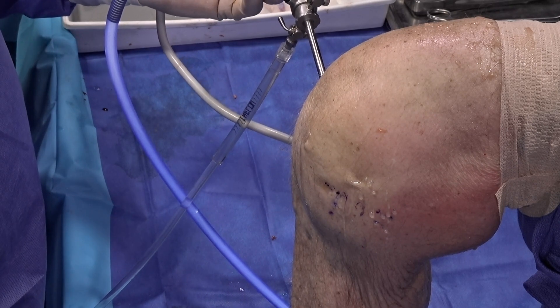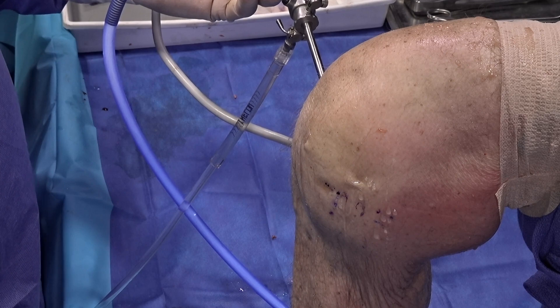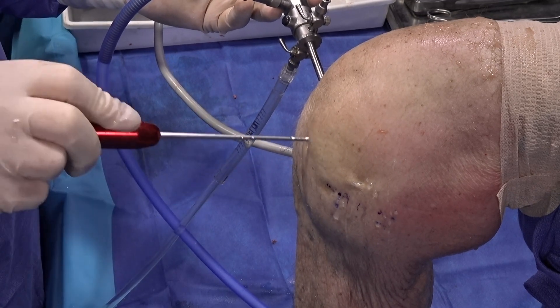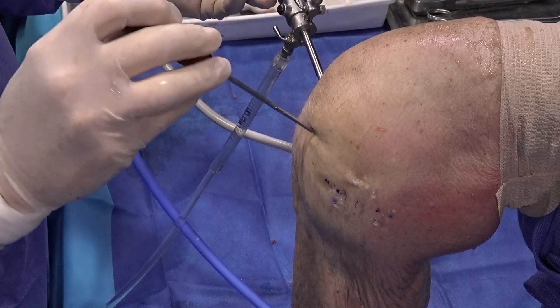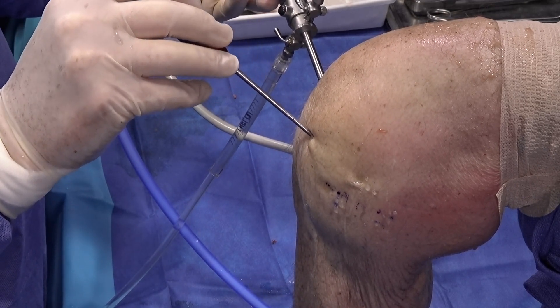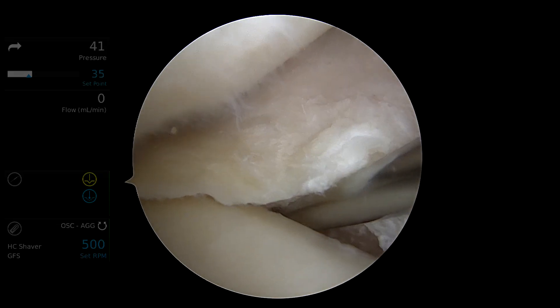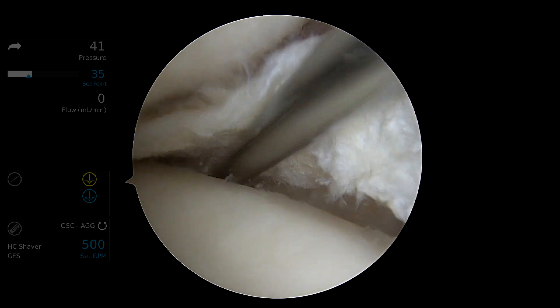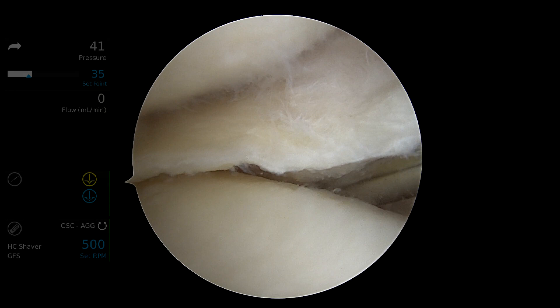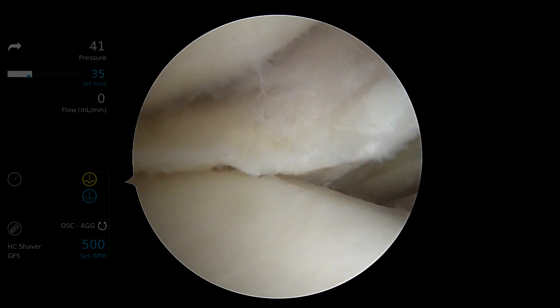Once we've addressed the intra-articular pathology, we're going to prepare the tissues for meniscotibial ligament repair. The first step is preparation of the medial meniscotibial ligaments. An arthroscopic rasp is placed deep to the meniscus in the gutter to roughen both the medial tibial metaphyseal surface below the articular cartilage and also to roughen the meniscotibial ligaments.